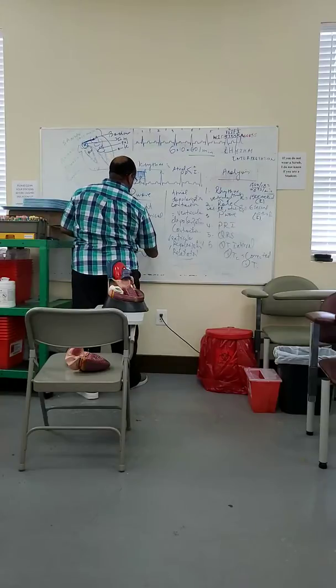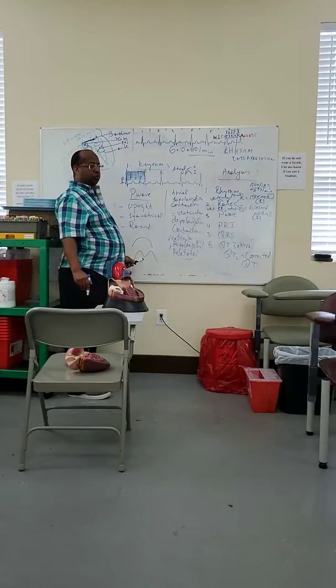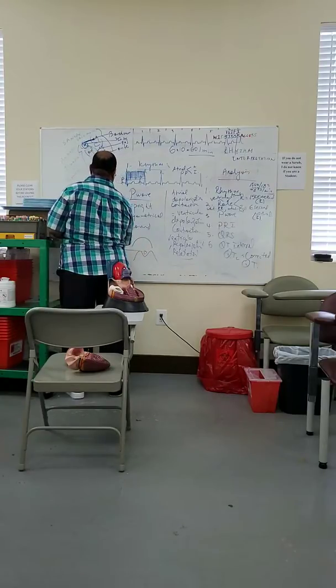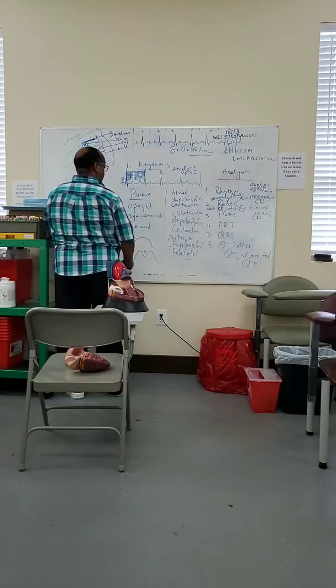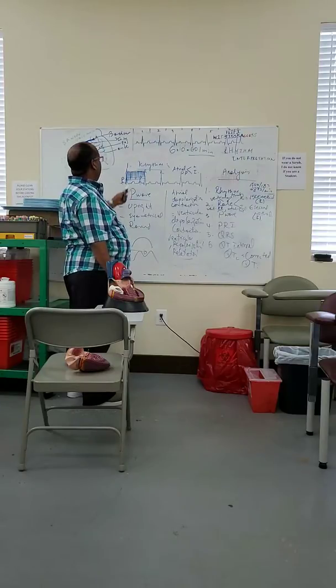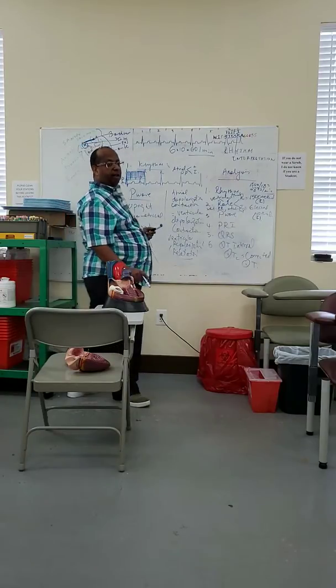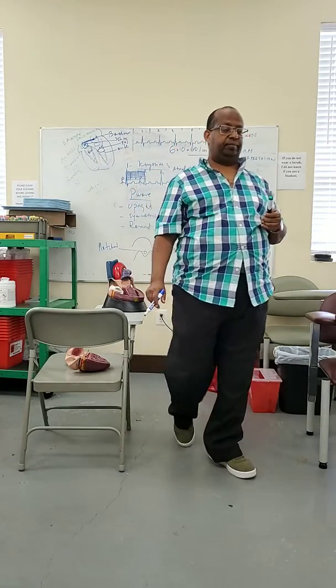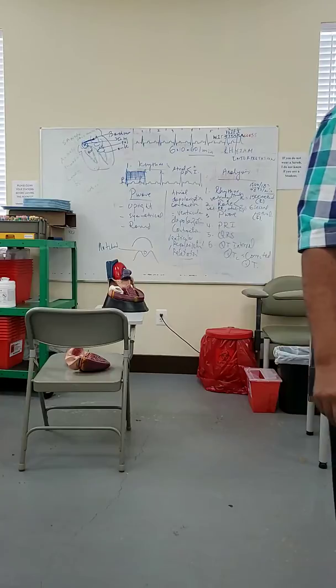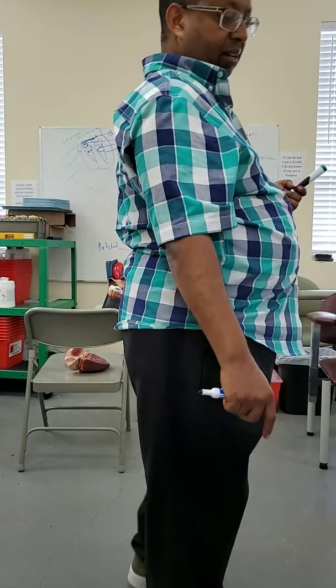For example, this kind of P wave, is that normal? No, because it's not round. This is called a notched P wave. So what about a slight arch? Can you draw it? Like this one? Okay. This is the T wave, not the P. The P there is this one. That one is round. It's round there too.